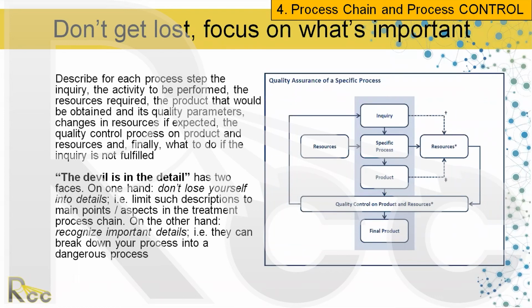And this is also why teamwork is really effective, because when you work with a team, you're going to have 5 different perspectives. So you're going to have a better idea or a better feel for the scope. So when you're going through the process and you're looking at these changes, this should be done in a team fashion.